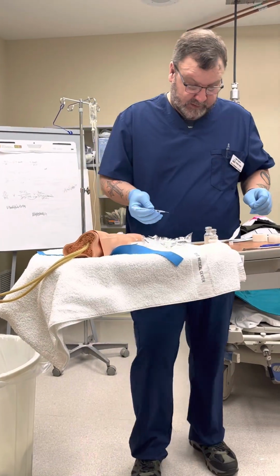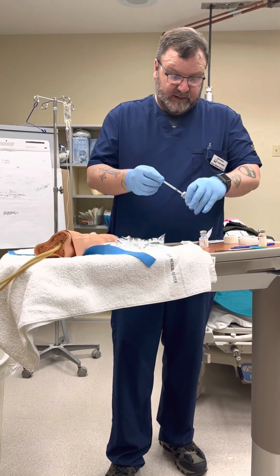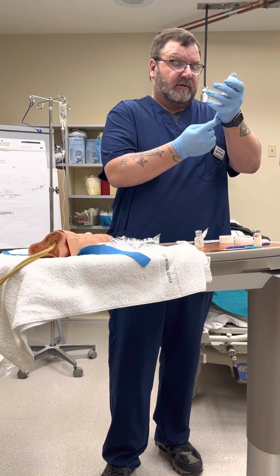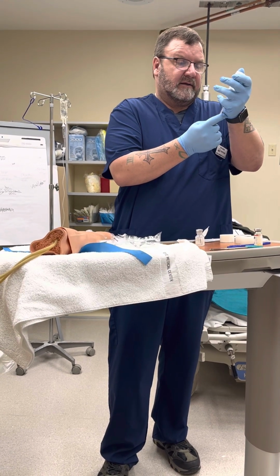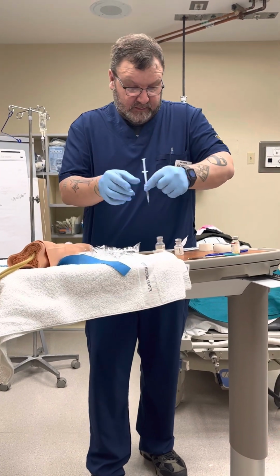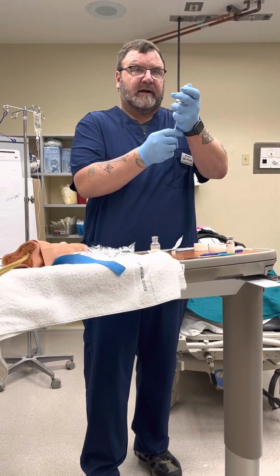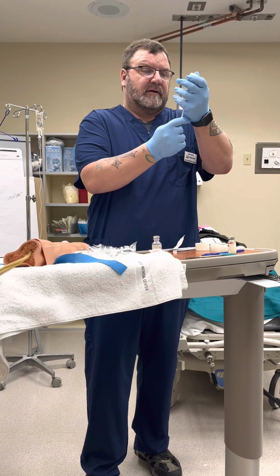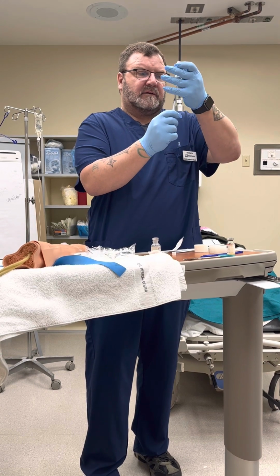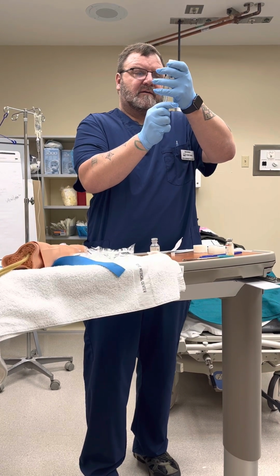So this is my Dilaudid, this is my saline. I'll go into my saline and remove 2 milliliters of normal saline. Perfect. Then I will go in and I will remove my 1 milliliter of Dilaudid. Check my numbers, check my medication. We're good.